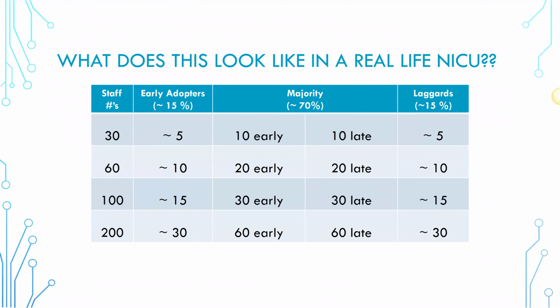Will you take a snapshot? Will you not take a snapshot? Will you save the file? Will you not save the file? Going back to the very beginning of your protocols, these are all decisions that you make to start, and that you may change as time goes by. But definitely think about all those different roles and who will document what, and to what specificity.